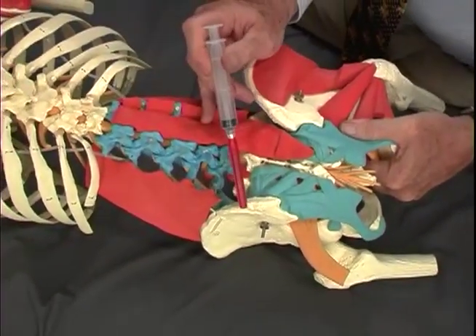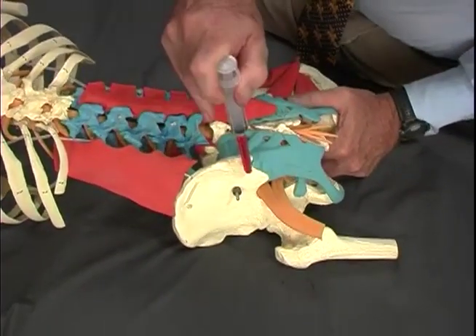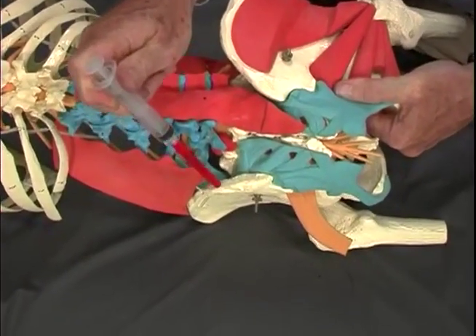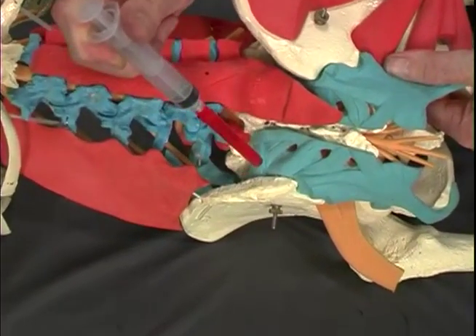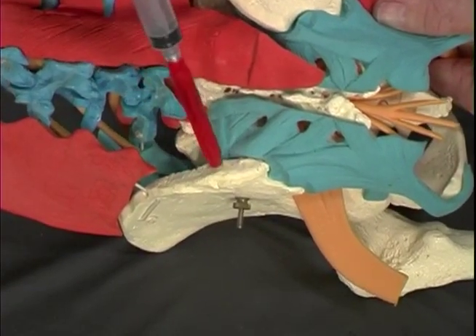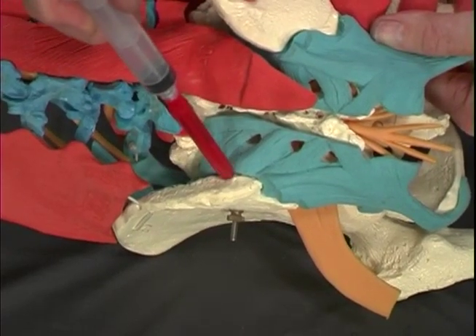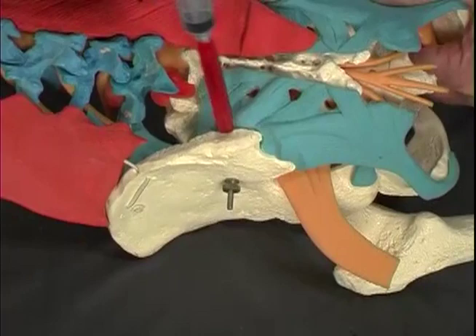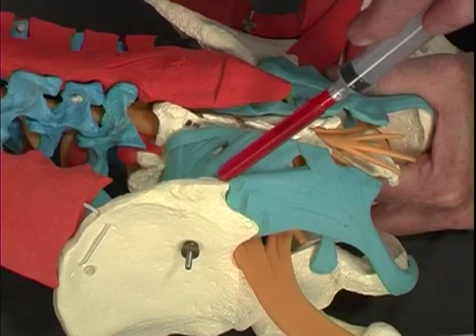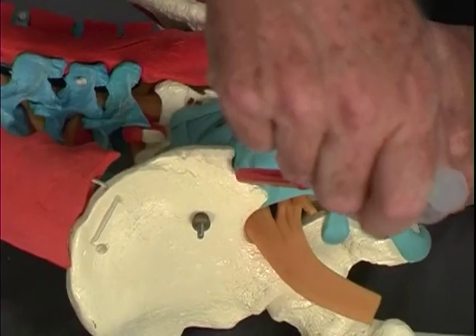We then think about areas A, area B, area C, and area D of Hackett. And so we're injecting on the ilium itself and then more deeply down into the sacroiliac ligaments with multiple injections into this area on the ilium, as well as deep down into the sacroiliac joint area. We then reorient our needle, coming around in a more cranial direction to hit the bottom fibers of this, points C and area D.